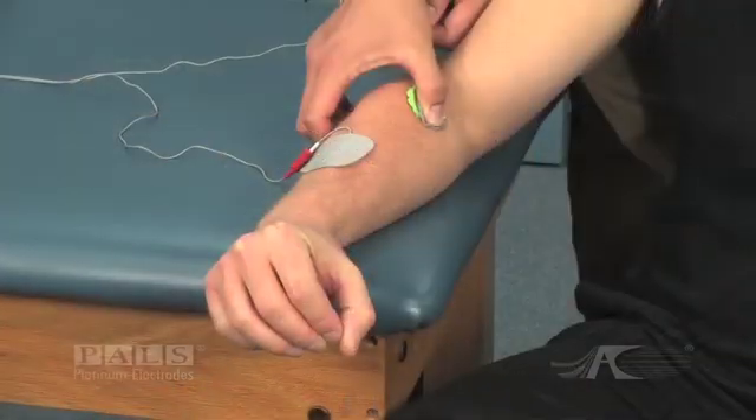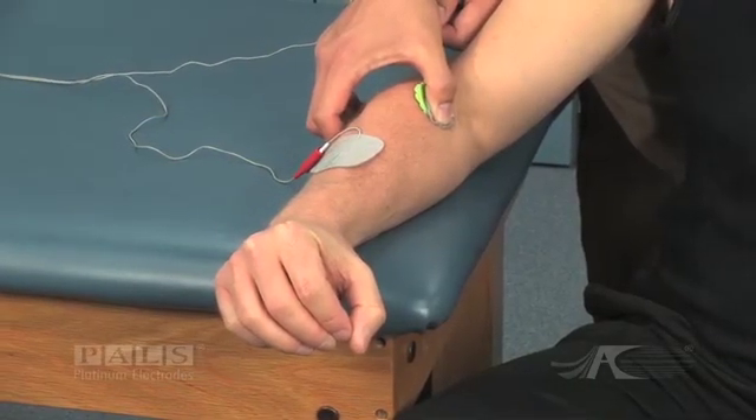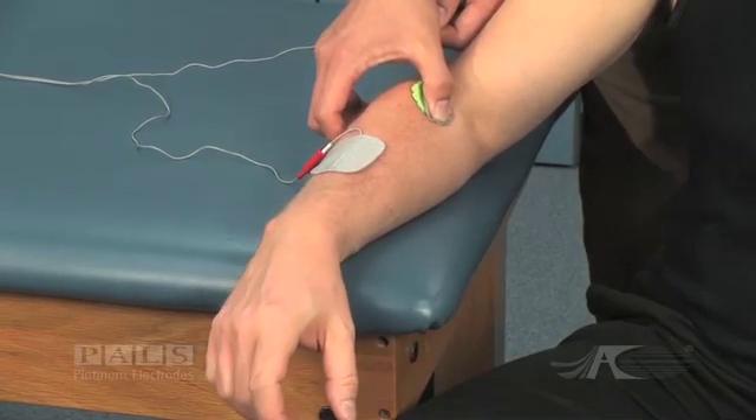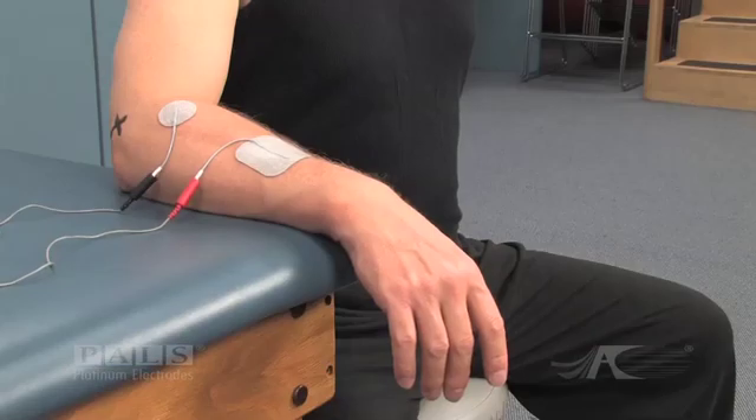Be careful not to touch the patient as you are moving the electrode, as you may become a part of the circuit and receive a low level of electrical current. When the best possible electrode placement has been identified, remove the sponge and place the electrode immediately on the patient's skin.